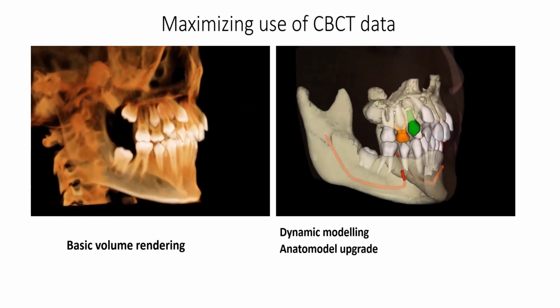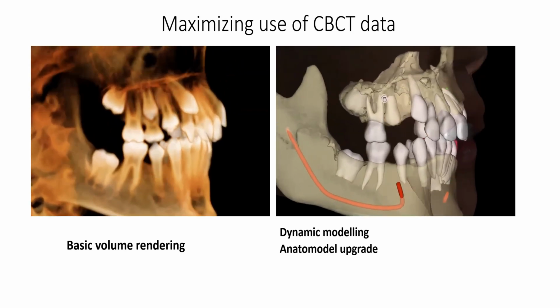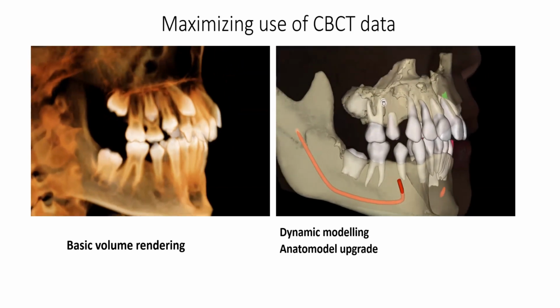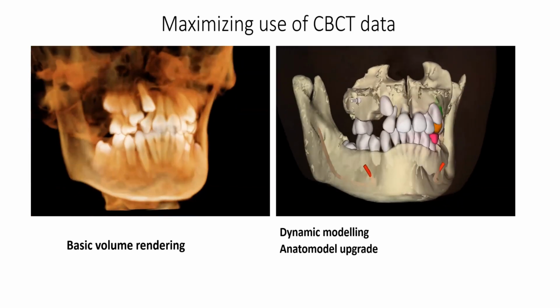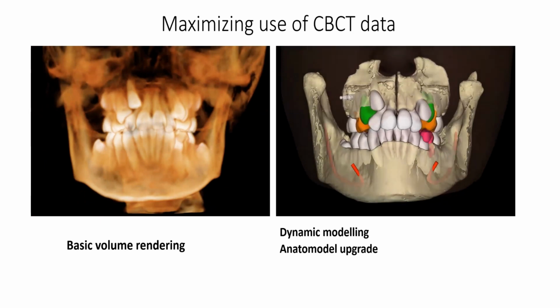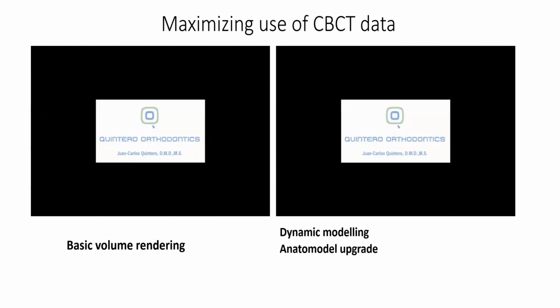We are allowed to move these teeth. Okay, we have a very hairy, impacted upper right canine. One possible solution is extraction of a premolar, but then we have to think about biomechanics and vectors. How do we move that canine down without bumping into the root and resorbing the root of the lateral incisors, right? So I can simulate this expansion that we're going to do.